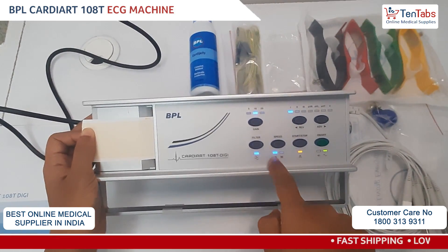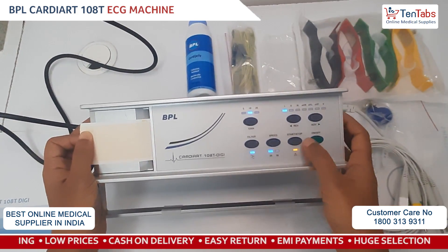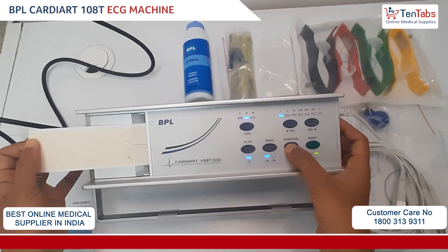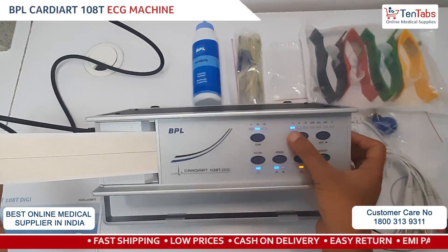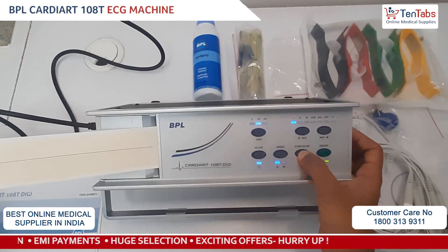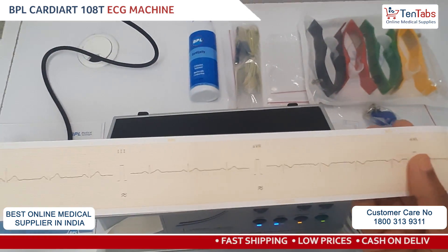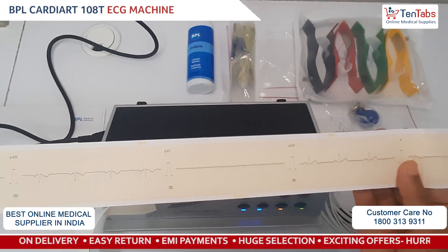To start and stop the printing, we need to press the start/stop button. You can see the print for lead one, which we have selected. Stop. This is one of the sample ECG waves — the report of the single channel BPL 108 ECG machine.